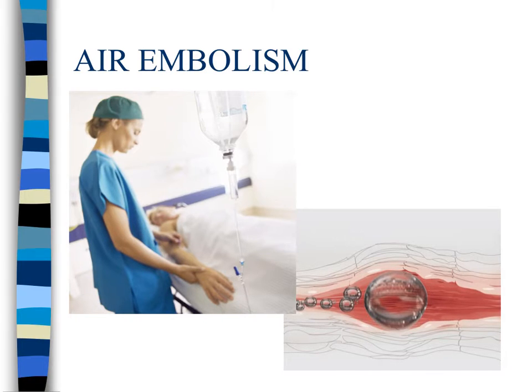Nursing interventions when an air embolism is suspected include discontinuing the infusion, placing the patient in Trendelenburg position on his left side to allow air to enter the right atrium and disperse through the pulmonary artery, administering oxygen, immediately notifying the physician, and documenting the patient's condition and your interventions. Preventative measures include clearing all air from tubing before attaching it to the patient. Monitor solution levels carefully and change the bag before it becomes empty. Frequently check to assure that all connections are secure.